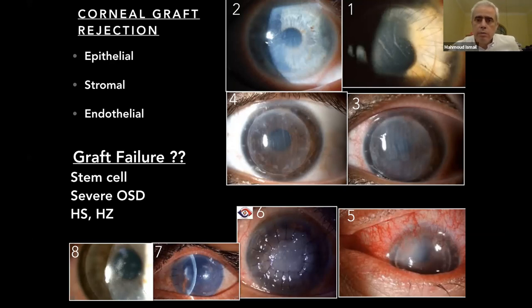I used to do pre-setting cauterization, either with diode laser or by fine needle cauterization. Nowadays I don't do this. I do it on the spot through the conjunctiva with the endocautery probe. I cauterize the main vessels coming from outside the limbus, the feeder vessels. But the injection should be done some time before. If you want to do an anti-VEGF injection, be careful that this is just a temporary measure. Okay, thank you very much.